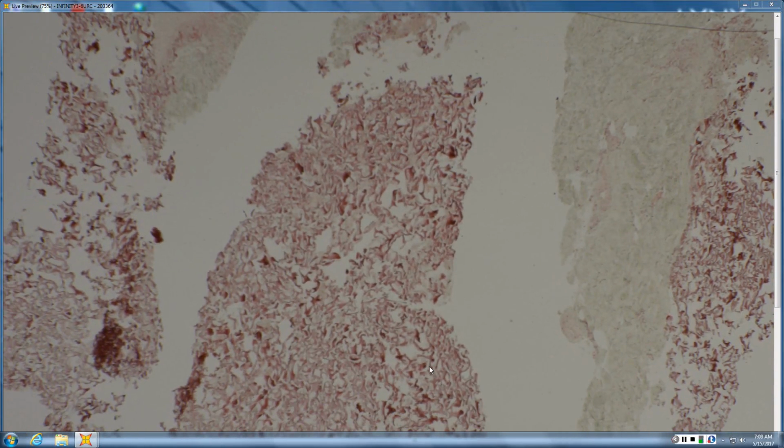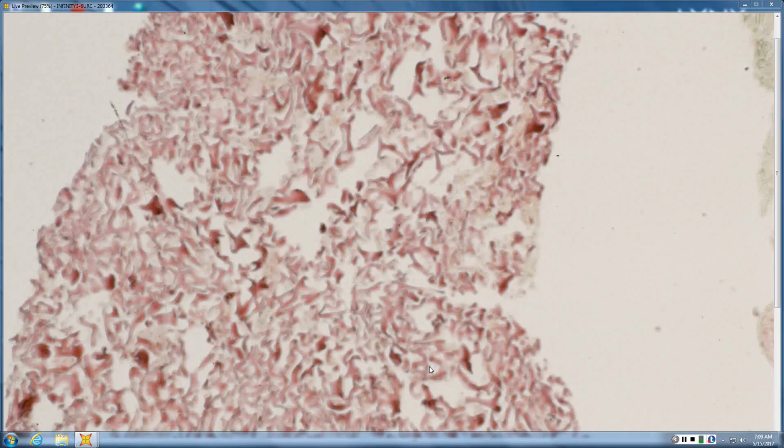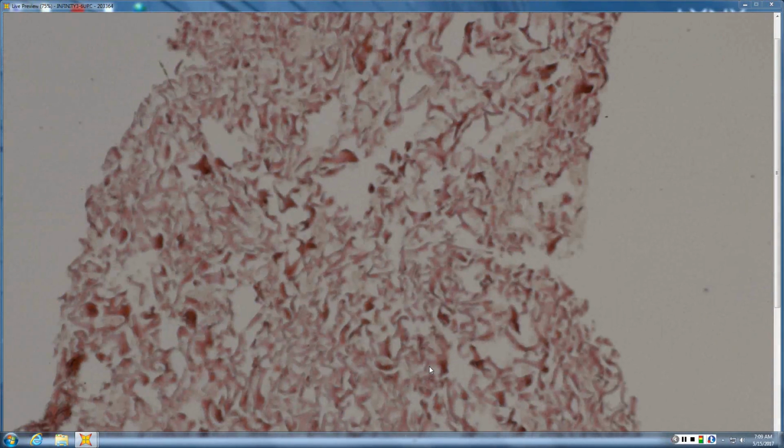Usually, if you just spend a little bit of time to memorize them, they have very characteristic appearances. This one has what's called the arabesque pattern, which goes with Gelfoam. And for a while, I didn't really know what arabesque meant per se, so I Googled it. If anyone hasn't Googled that yet, basically it's kind of like the old school Moorish architecture and Middle Eastern design, and you'd recognize it if you saw it because you see it on rugs and things. But that's what that means.